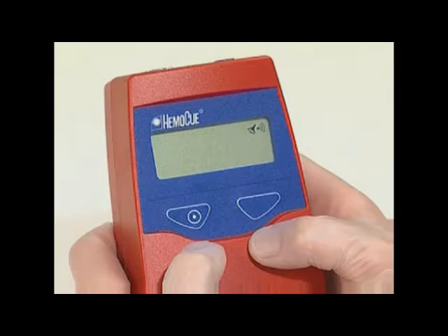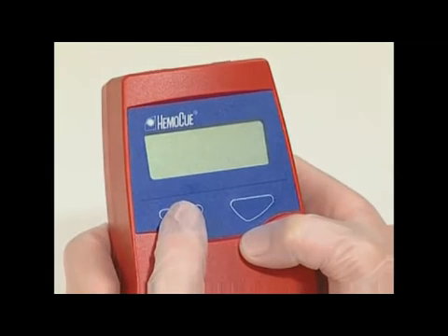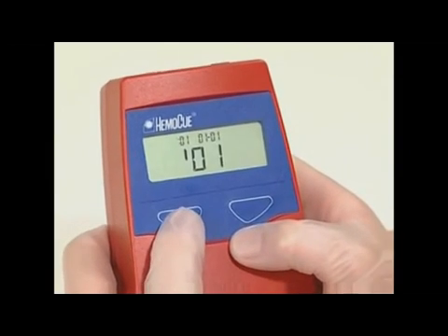The signal can be activated or deactivated by pressing the left button. Continue to scroll using the right button until the display shows characters for time, year, and date. The hour figure will be flashing.